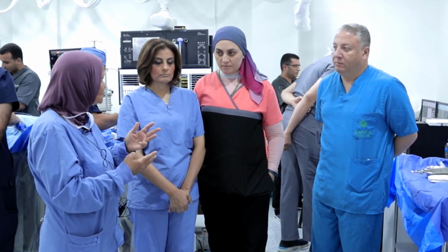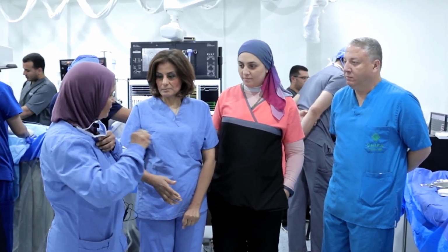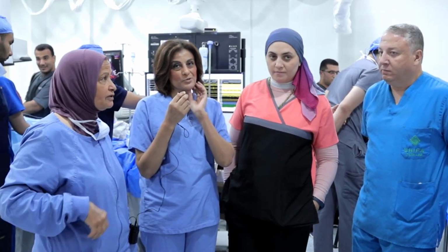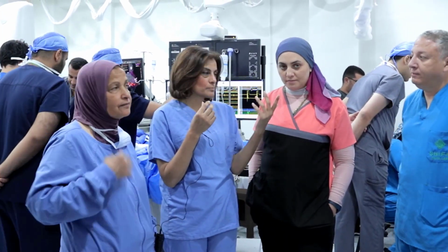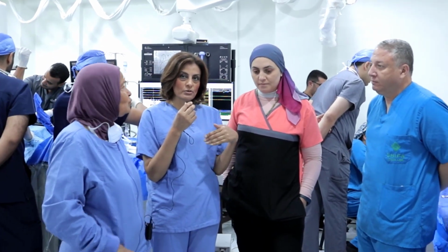We had three types of tachycardia. There were three types of atrial tachycardia. All of them, I think, were coming from the right atrium, because I didn't see them in the left. So we decided to go with CARTO.